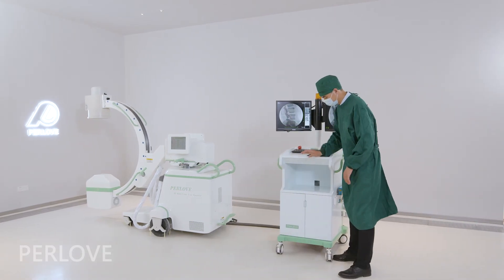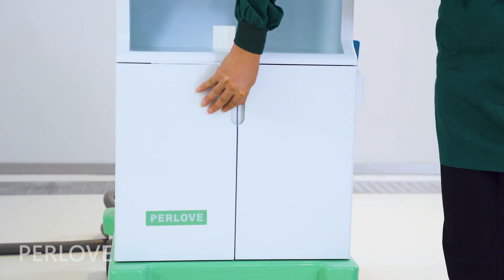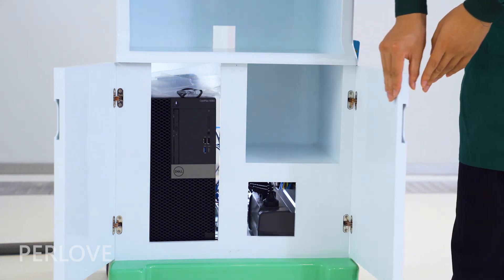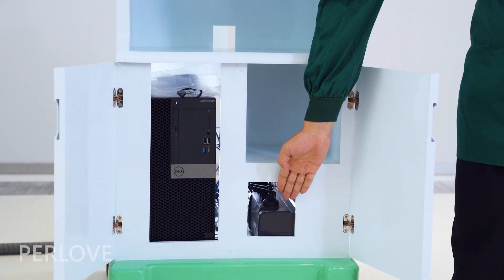The workstation is equipped with a UPS power supply that can ensure the computer can last for 10 minutes after power failure.